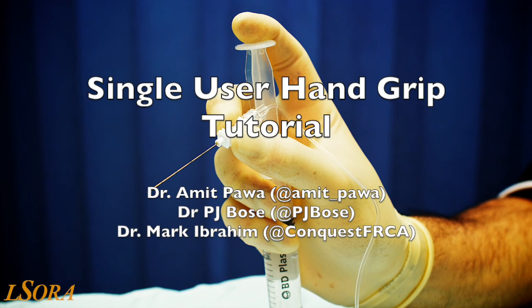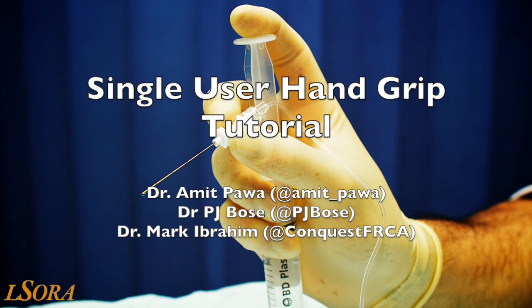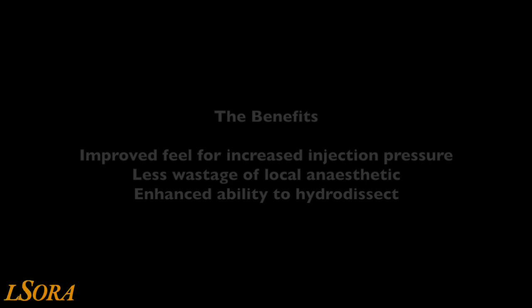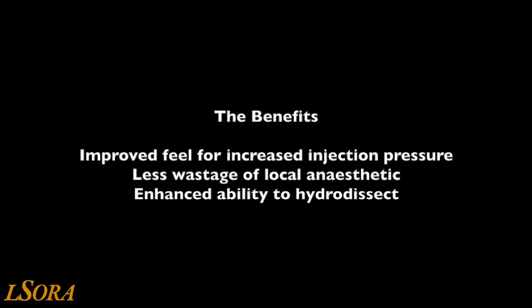In this video, we will show you three techniques for single-user hand grip during ultrasound-guided regional anaesthesia. The perceived benefits for single-user injection in this setting relate to the ability of the person performing the block to assess the injection pressure themselves, for there to be less wastage of local anaesthetic, and for there to be an enhanced ability to use the hydro-dissection technique when performing blocks.